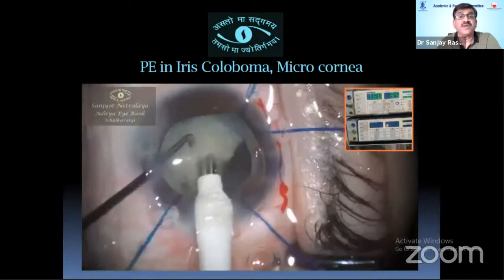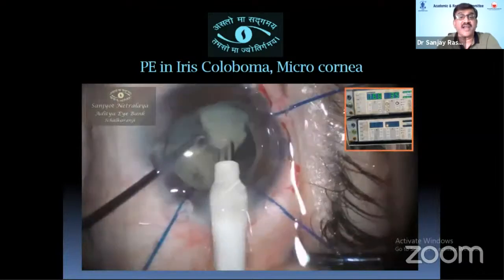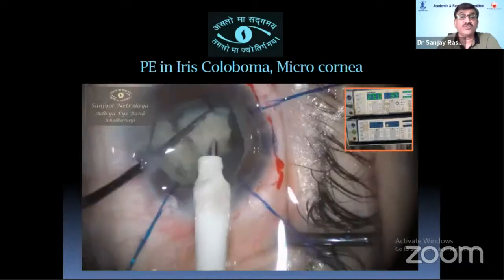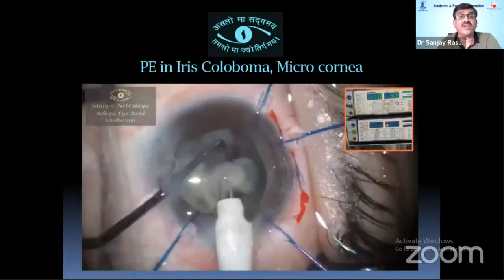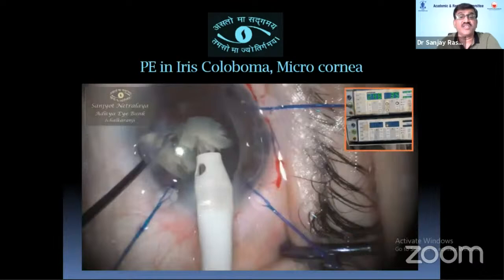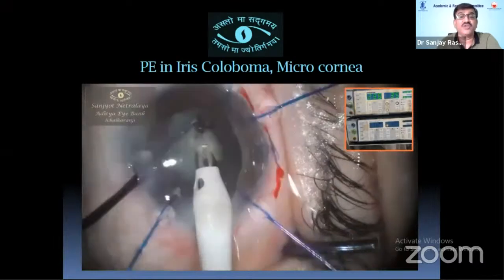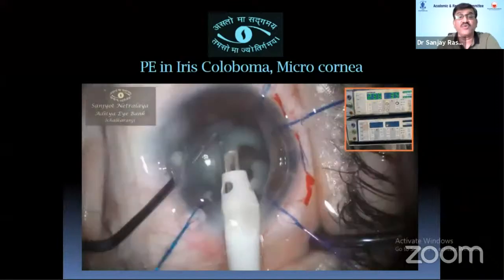the forces that are acting centripetally towards the tip of the phaco tip. So no strain on the zonules. All remaining left side half of the nucleus is divided and emulsified subsequently. One part of the left half of the nucleus is kept all the way in the colobomatous area to support that area.